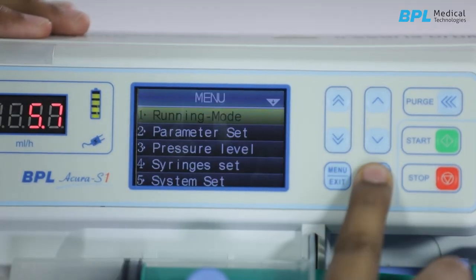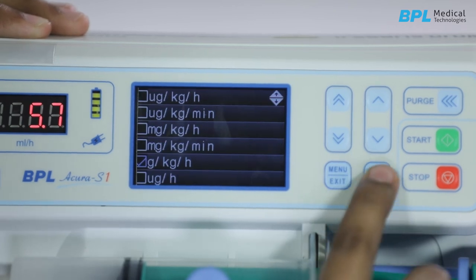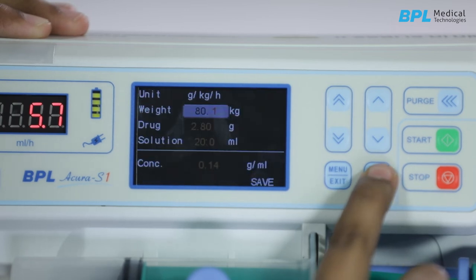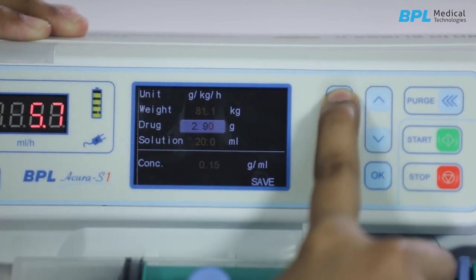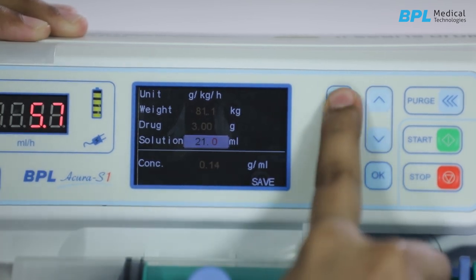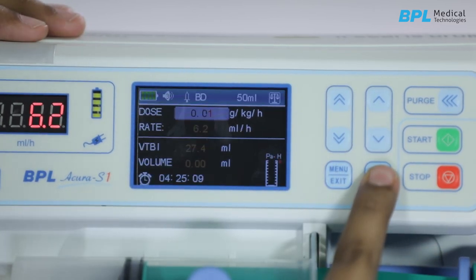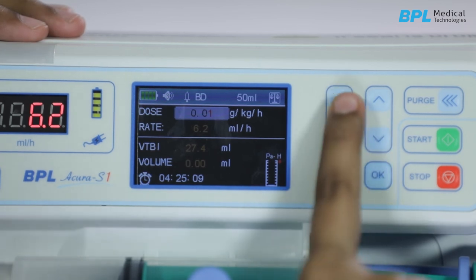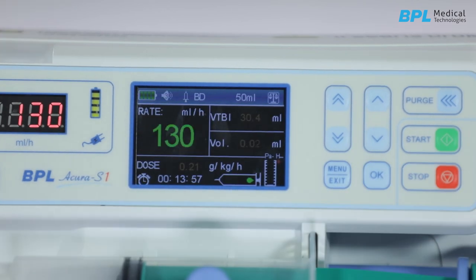For drug or weight mode, in running mode select drug or weight mode and confirm. The system will enter into the unit selection screen where there are seven selectable infusion units. Select the desired unit and confirm. Adjust the drug amount, solution volume, and body weight respectively — the solution concentration shows automatically. After these three parameters are set, press OK to enter the drug weight syringe interface. Press OK to adjust the drug dose and the flow rate shows automatically. After all parameters are confirmed, press start to begin injection.